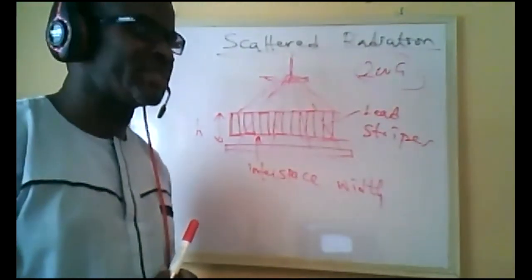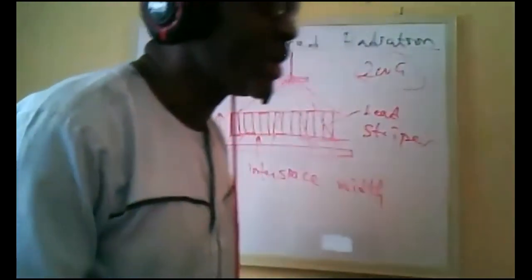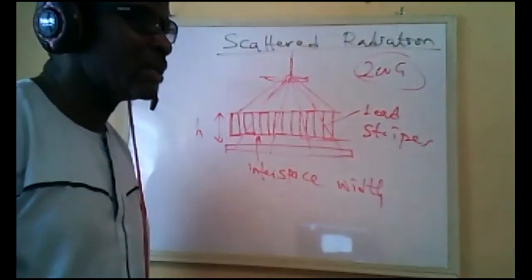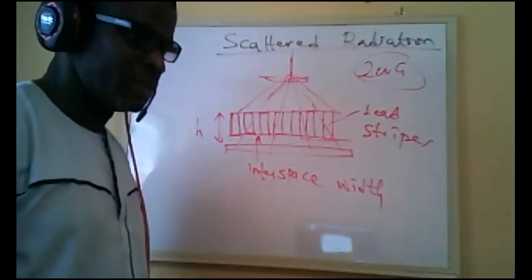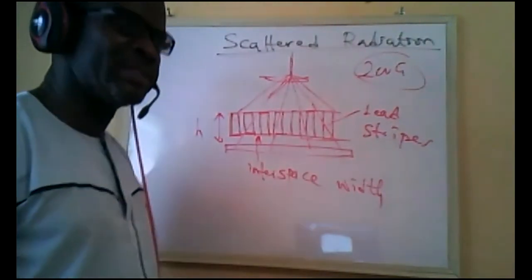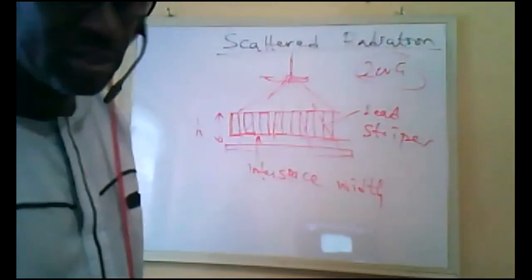Even apart from the grid, we have to have well-trained radiographers to handle the screen, especially in digital radiography, because you wouldn't be needing or replacing films. And if we begin to replace film, people begin to ask the question, why are you retaking this so many times? You have to answer to that, since digital radiography is just there.